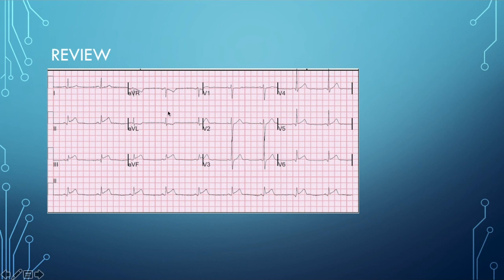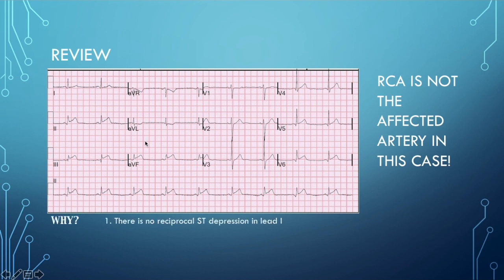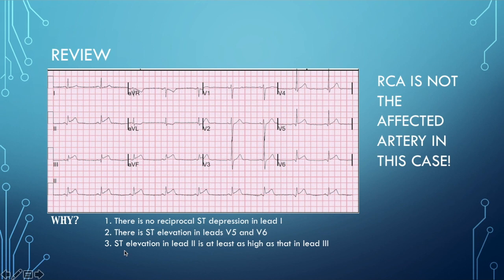For a quick review, here's the 12-lead without any markings. You can see ST elevations in leads 2, 3, and AVF — it's an inferior infarct, but in this case the RCA is not the affected artery. Why not? Number one, there's no reciprocal ST depression in lead 1. Two, there are ST elevations in leads 5 and 6 as well. And three, ST elevation in lead 2 is at least as high as that in lead 3 — they're about the same height. These three criteria are highly correlated with a circumflex occlusion.